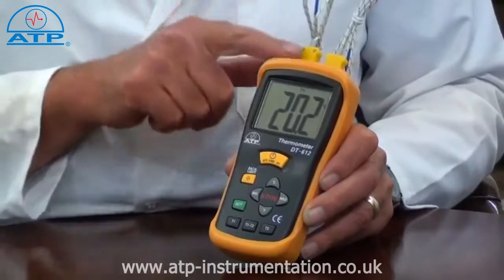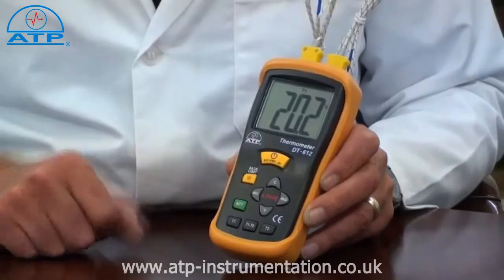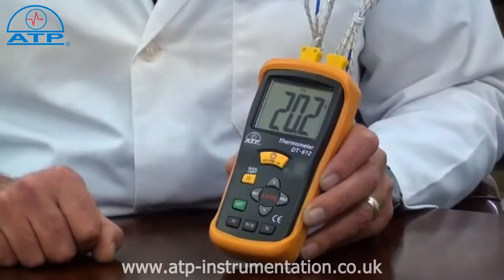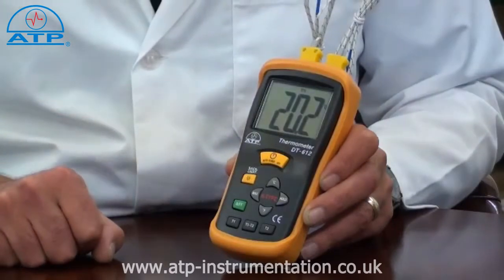Having two probe inputs, the thermometer can be used to measure two temperature sources with an easy selection of individual measurements or differential. Differential displays the difference in temperature of probe 1 temperature minus probe 2 temperature.